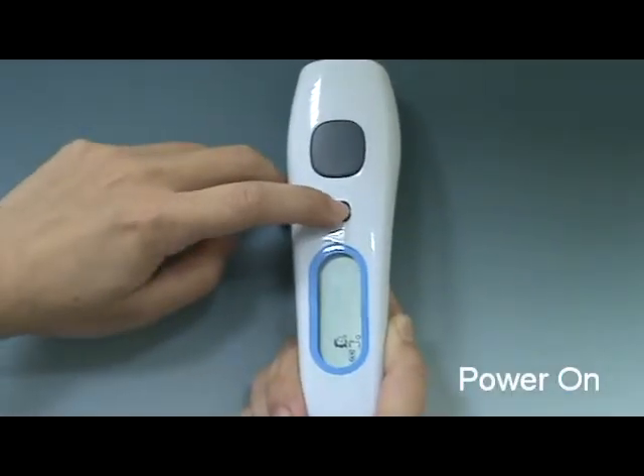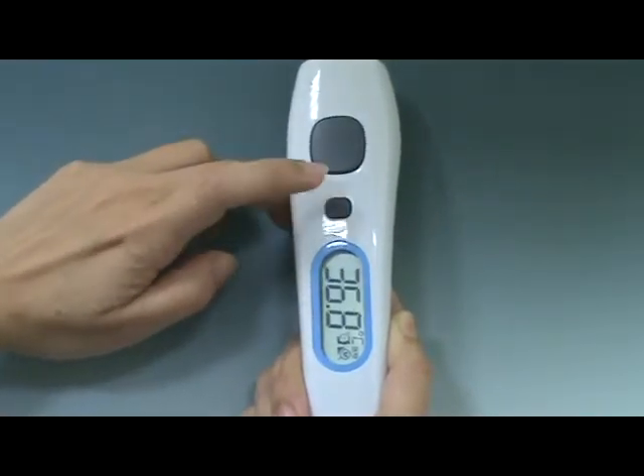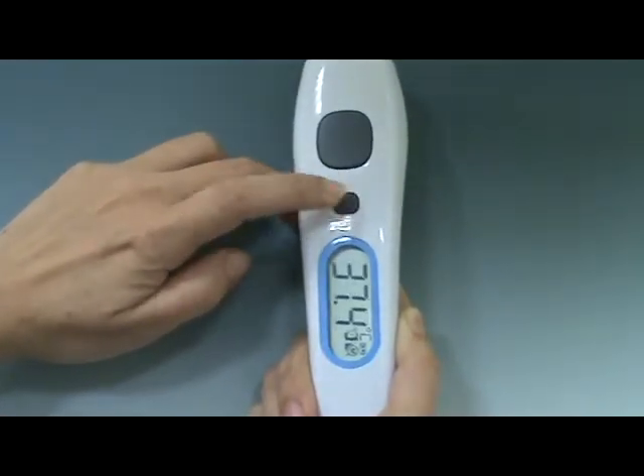After powering on, press the main button to view the temperature records. There are a total of 25 sets of stored measurement records for forehead measurements.